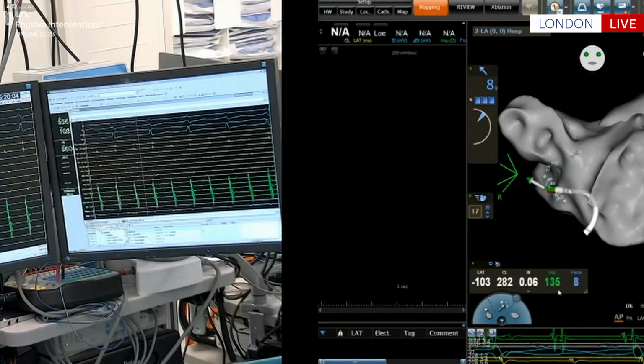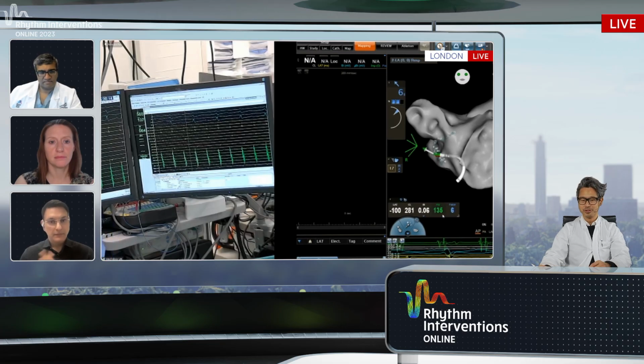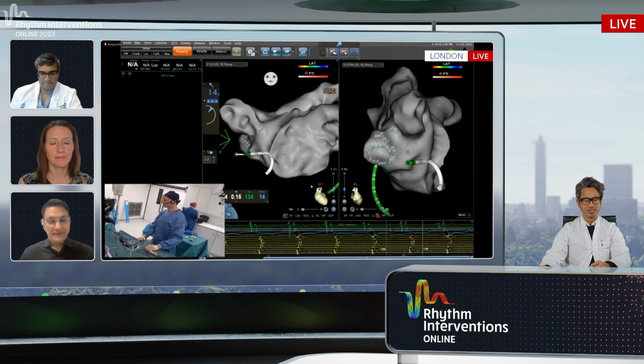Just above 3.4 on the BARD, so everyone can compare that timing with the PV 3.4. 30. So Diraj, I see you nodding, probably you would also have a very similar workflow in your lab in Liverpool, or how would you comment on that?